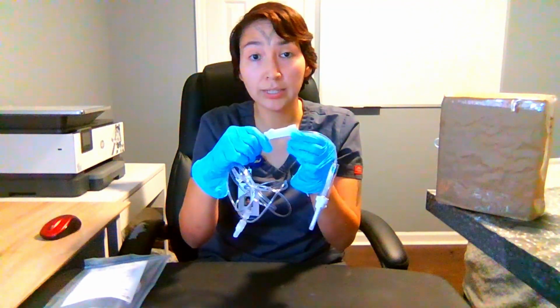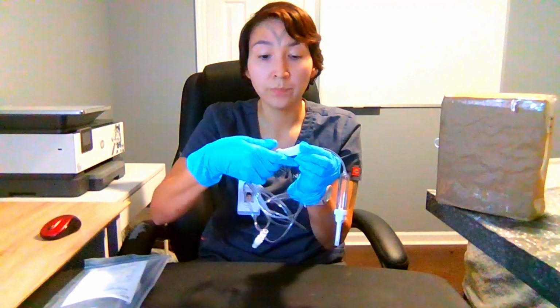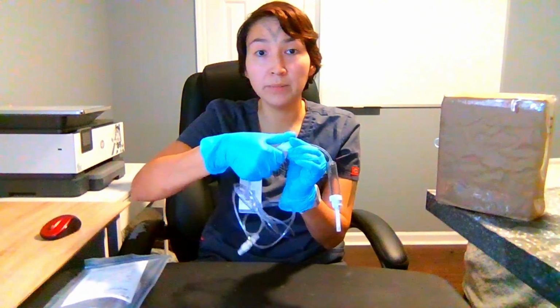This is the roller clamp. It is used to adjust or stop the rate of flow. Right now it is fully closed, but I can roll it to be open, closing it all the way.